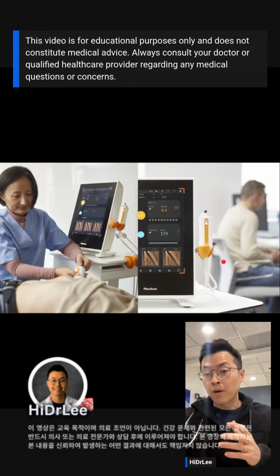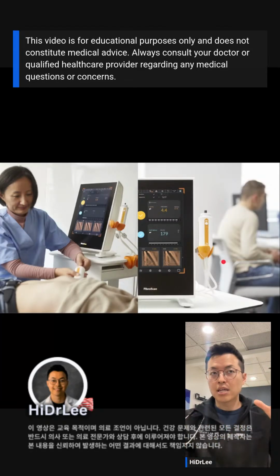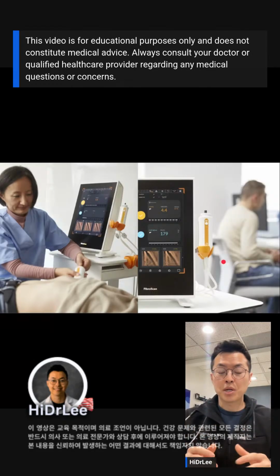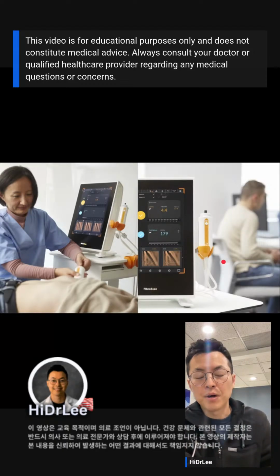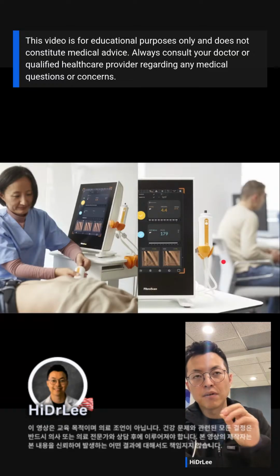When we are overweight, when we gain weight, the fat doesn't always stay under the skin. It may go inside the belly, which we call visceral fat, and it can even go into organs like the liver, which we call fatty liver disease. So Fibroscan is a tool that measures the fat in the liver.